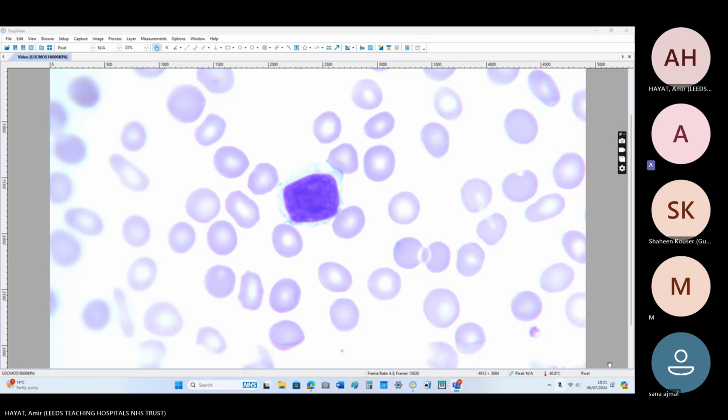But the morphology maybe looks more like, with abundant cytoplasm, I did not see pleomorphism, or I could not appreciate pleomorphism too much. But this flow cytometry goes with mantle cell. And the morphology goes with, I think, monocytoid type or marginal zone type of mantle cell, because there is abundant cytoplasm.